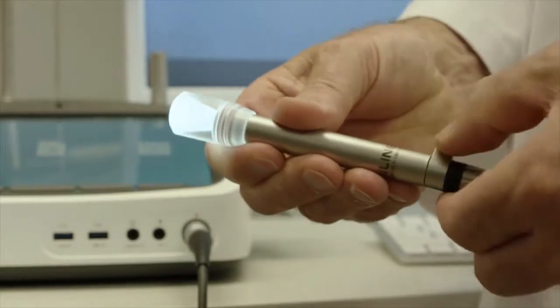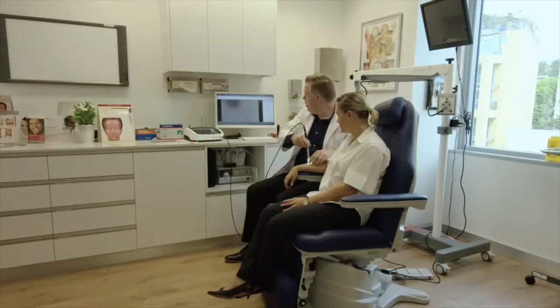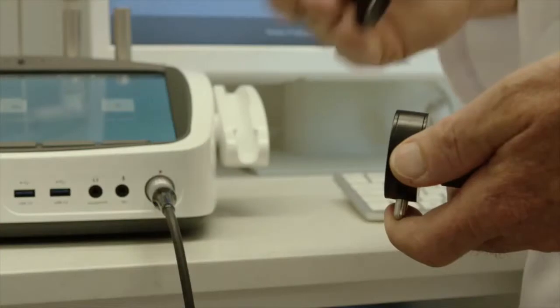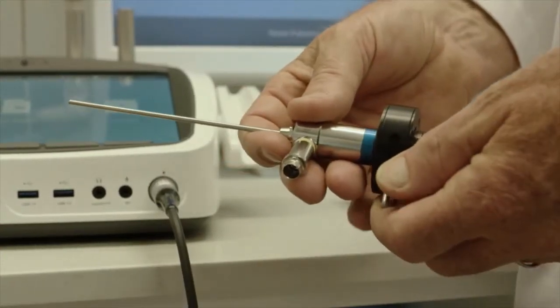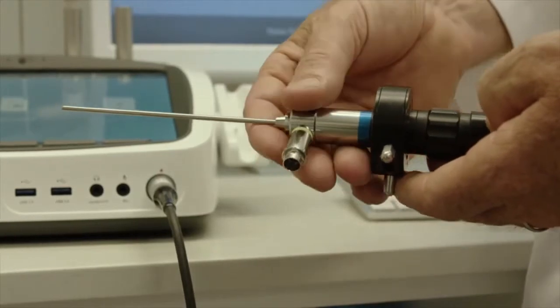The dermatology probe can be used for high magnification examinations of lesions and skin irregularities. The illumination is homogenous and a reticule tip is also available for the probe to facilitate measurement of objects under examination. The endoscope adapter allows the use of third party endoscopes thereby facilitating wide range medical examinations.